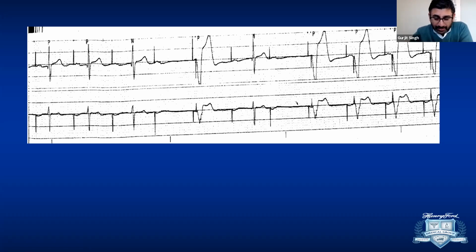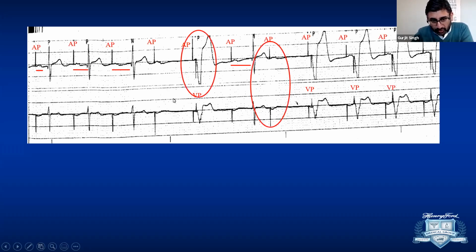And remember, I said, keep these ECGs simple. Either there is some fracture going on, some algorithm working, or some undersensing and oversensing. So this is a Medtronic pacemaker in MVP mode. I'm going to label this for you. The first three complexes are A-paced, followed by the patient's own QRS. At the fourth A-paced, you see a captured atrial, but there is no ventricular signal. And then you have another A-paced at the programmed pace rate, and then the ventricular pace comes at 80 milliseconds.